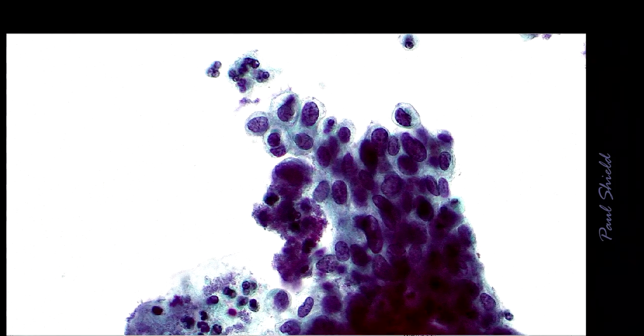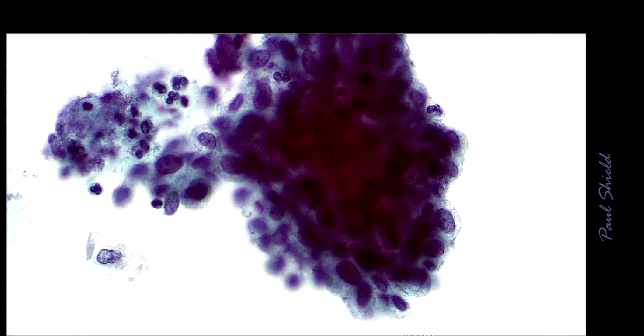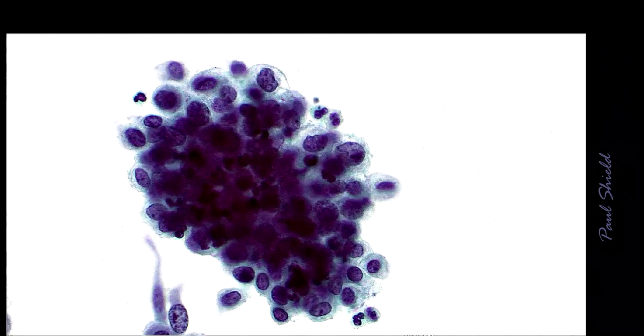Another group, this is extremely hyperchromatic. I can't really even see in the middle. Almost looks like endometrial cells, doesn't it? But there is much too much variation in size and shape amongst these cells that you can see around the outside, just another group, for them to be endometrial.